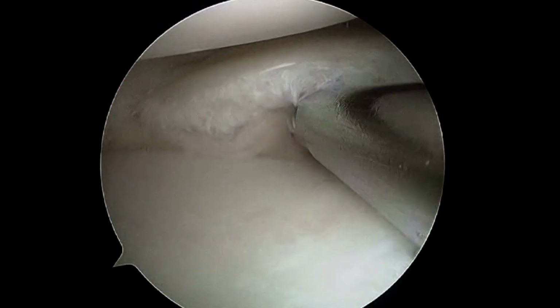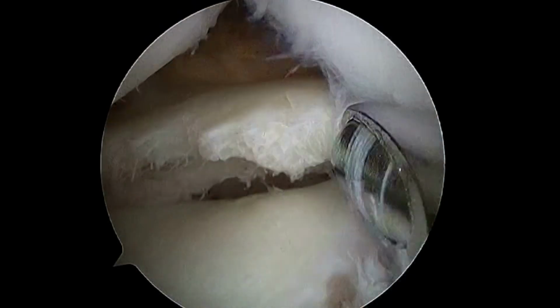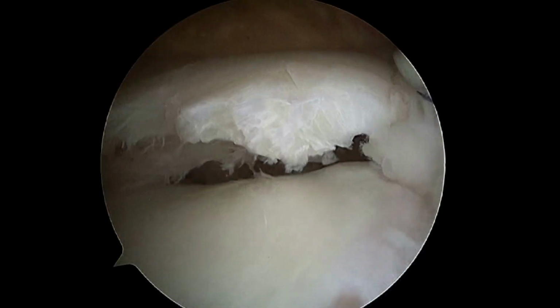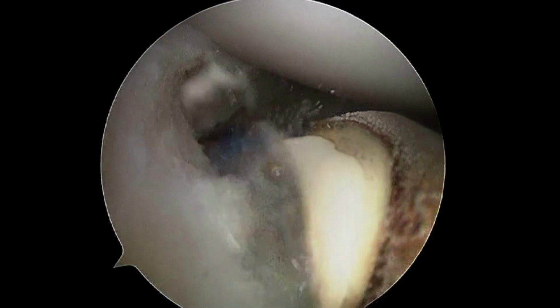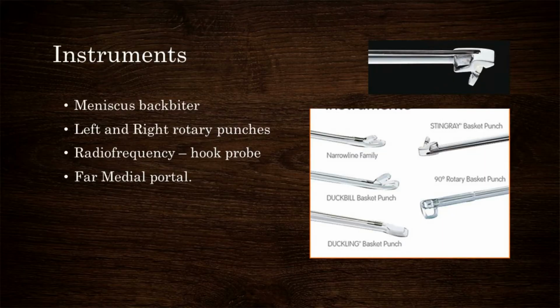Further trimming is carried out and the posterior attachment was confirmed. Further smoothening of the frayed meniscal edges is done with a radiofrequency device. Discoid meniscus tears could be rare. One may require special instruments like backbiting meniscus punches and rotatory meniscus punches to deal with the anterior third. A far medial portal can also be helpful to address these lesions.